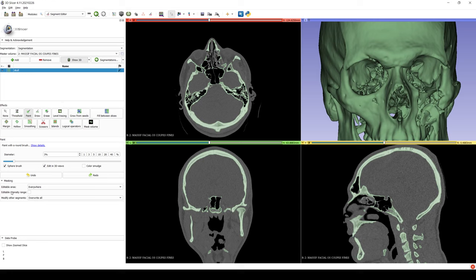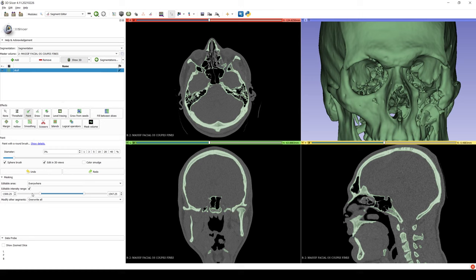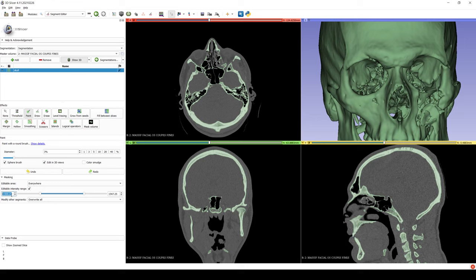Then click on the Editable Intensity Range. The numbers you want to use here are trial and error, but usually they'll be between 45 and 150 range. Here we're going to use 55 to 130 and it seemed sufficient for our image.